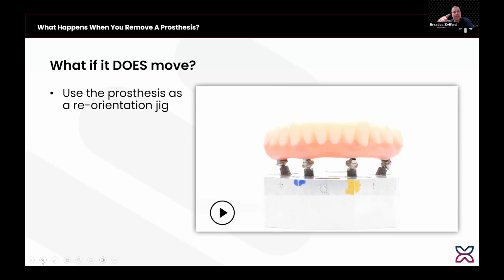So if you're talking about torque test of the ball abutment engaging with the implant, then no, you can go ahead and torque it, put the orientation screw back on, or reorient it back to its position. And that's kind of the point of this slide right here.